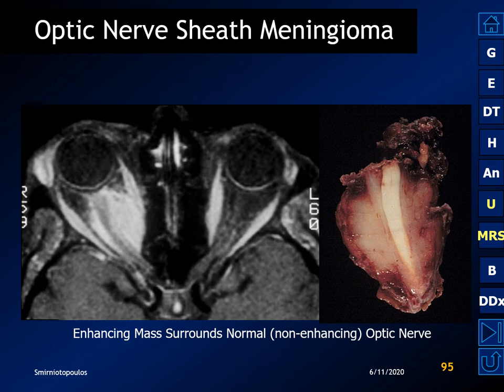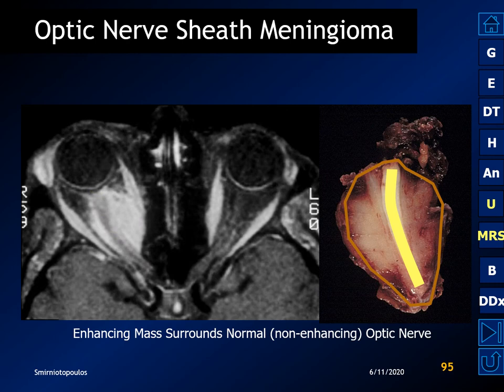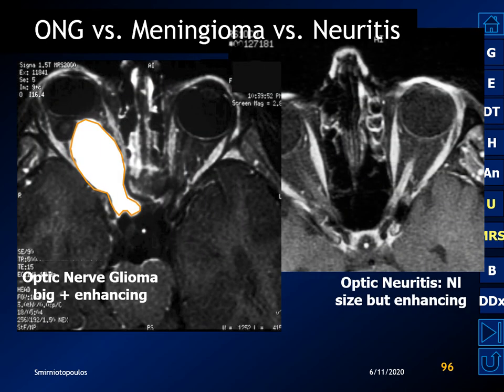Here is a beautiful example of radiologic-pathologic correlation — an optic nerve sheath meningioma where the enhancing mass surrounds a non-enhancing but normal optic nerve. In contrast, an optic nerve glioma shows a fusiform mass that enhances, and we don't see the optic nerve running through the middle because the mass is the optic nerve.